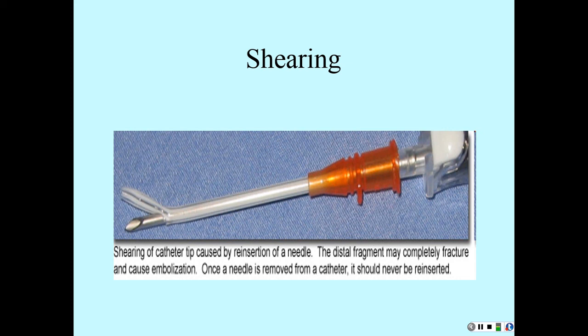So when you have a patient who, we call it throws an embolus, you have to intervene immediately because your patient's going to die. But what you do is you DC the infusion, you put your patient in Trendelenburg. Do you know what that is? Where you put them head down and their feet are up. Okay? And I don't mean just raise their feet. I mean do the bed so the bed is diagonal.